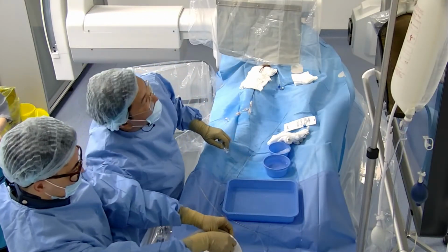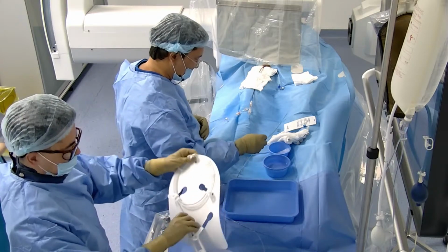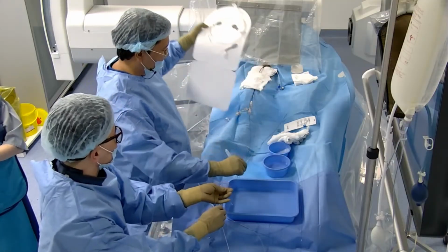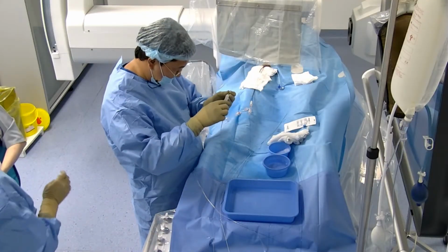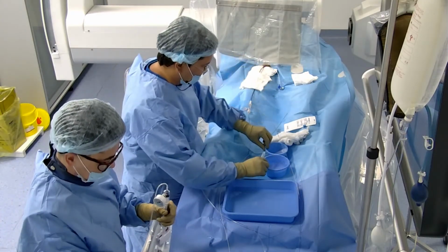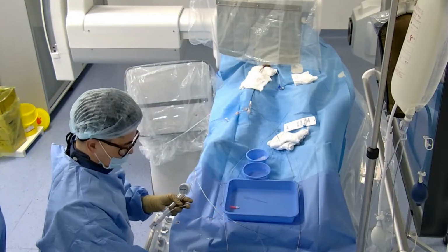Okay, let's check the pulse. 73. Okay, let's continue.